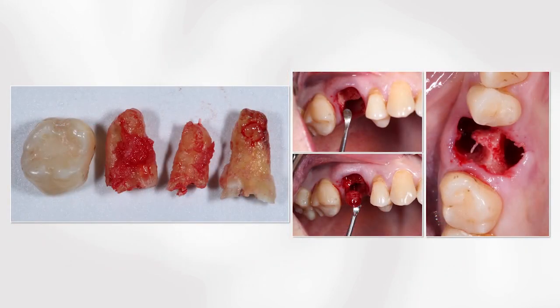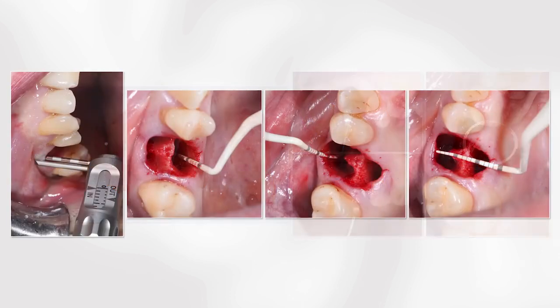Here you can see the crown and the roots, and we intend to use this crown to make our provisional restoration. After tooth extraction, the socket was cleaned and we preserved the interdental septum. At this stage, we measured the gingival thickness. We have barely half a millimeter thickness, and the loss of the buccal and the palatal walls was confirmed.